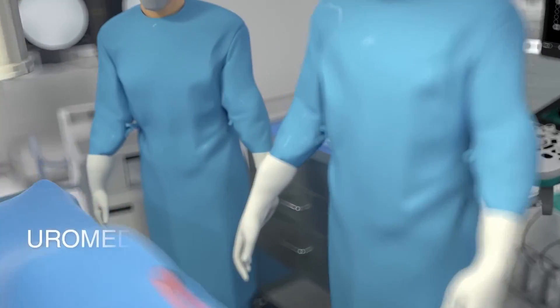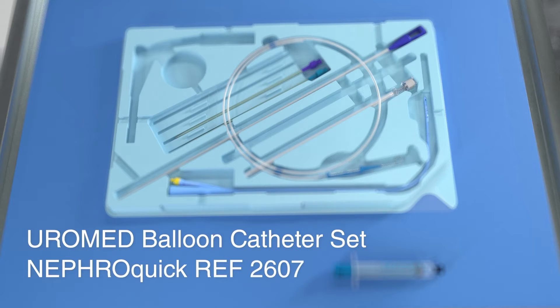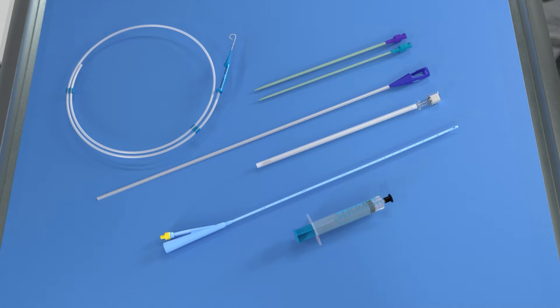The Euromed balloon catheter set NephroQuick, reference number 2607, consists of several components. It can be applied in just a few steps and yet combines all the advantages of previously known techniques.